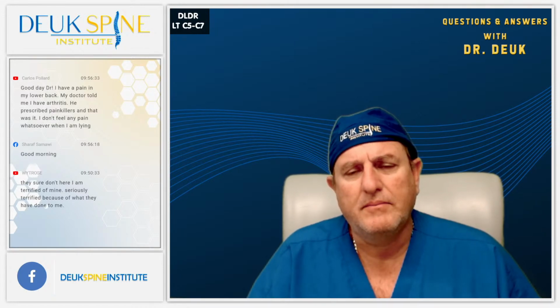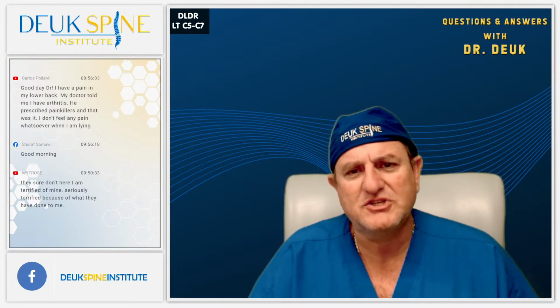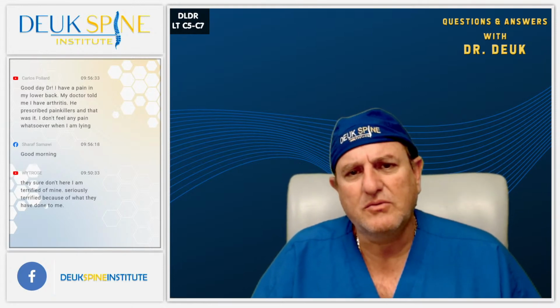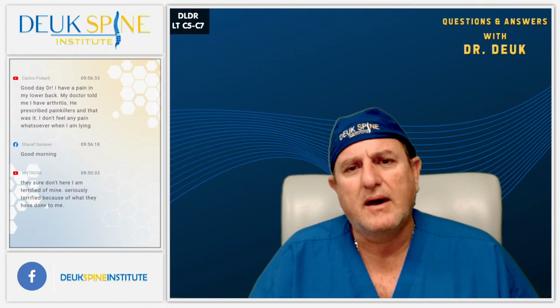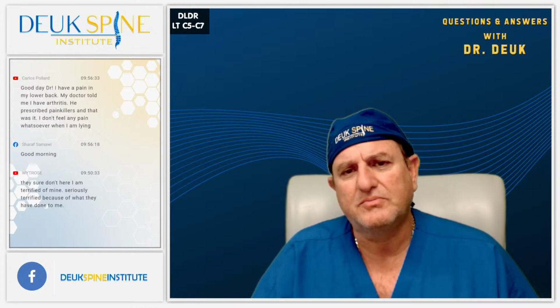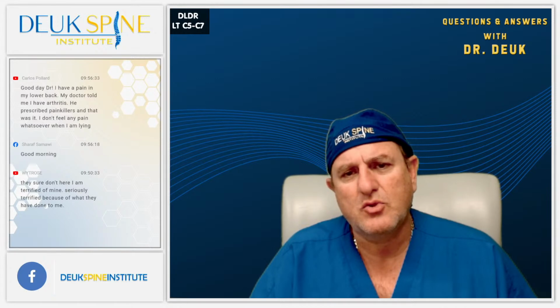One way to reduce risk of infection in spine surgery is to use disposable equipment because it comes prepackaged in sterile packaging, so it's a one-time use. There's no need for sterilization. But in general, almost every spine center uses reusable metal equipment, and it has to be sterilized properly. So if the facility doesn't have a good sterilizer, if they're not maintaining the sterilizer properly, if they're not setting the parameters on sterilization properly, if the tissue isn't being cleaned out of the instruments properly, you can get an infection from the actual facility and its equipment.